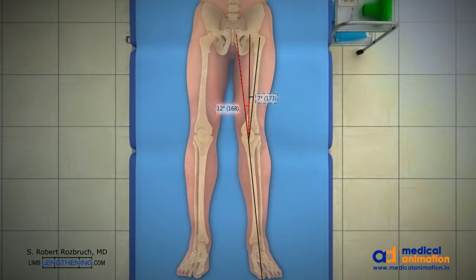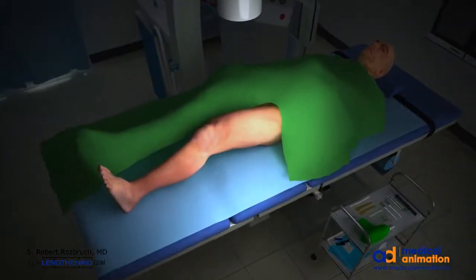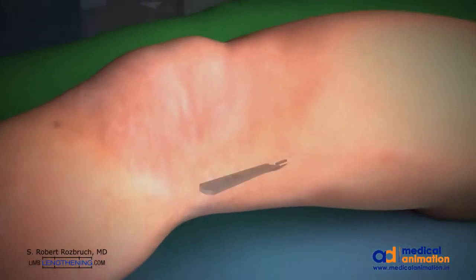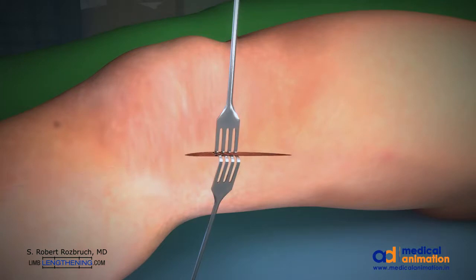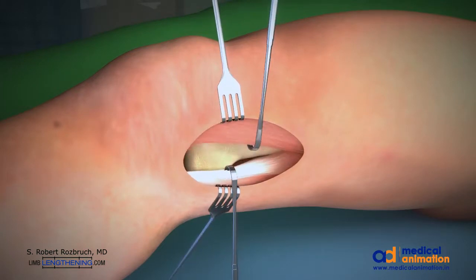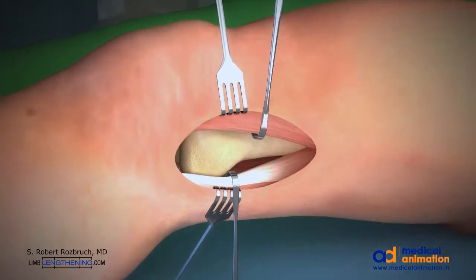This allows us to plan the size of the open wedge. We make a 4-inch incision on the lateral aspect of the leg and dissect the vastus lateralis anteriorly, exposing the lateral aspect of the femur.